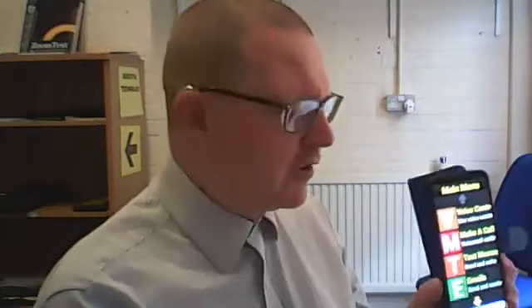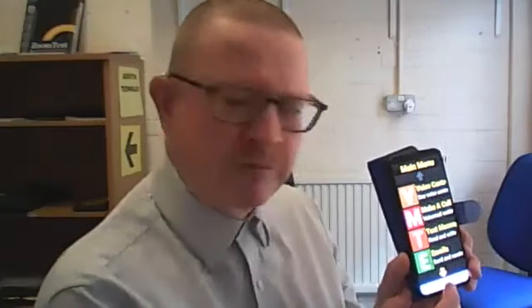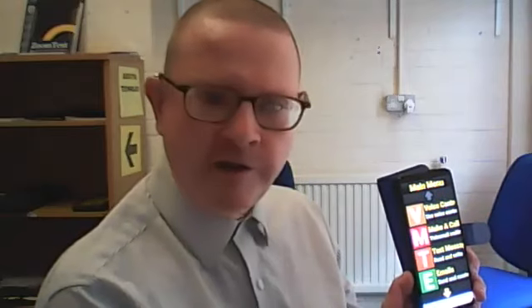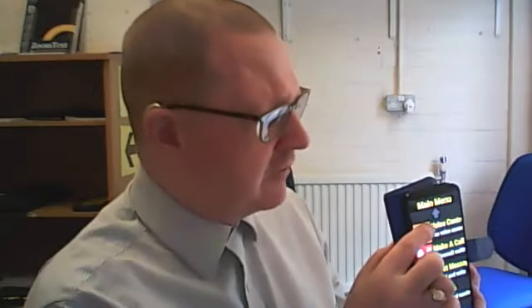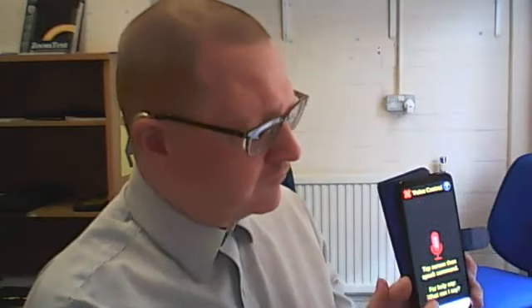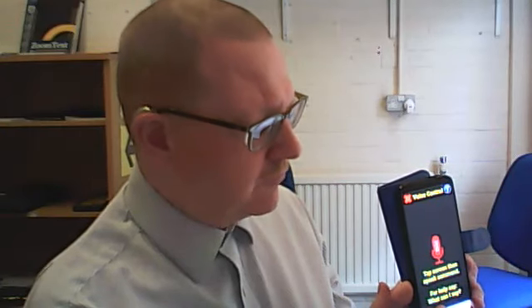Now, earlier I mentioned the voice control option on the first page of the main menu, and this can really speed things up, because if I wanted to go to RSS feeds, I would have to use my arrow key at the bottom of the screen 3 times, then go into entertainment, then use the arrow key at the bottom of the screen again to find RSS feeds. With voice control, I can just say RSS feeds, and it'll take me straight to it. I'll just go for it. Voice control. Tap screen, then speak command after the beep. For help, say, what can I say?